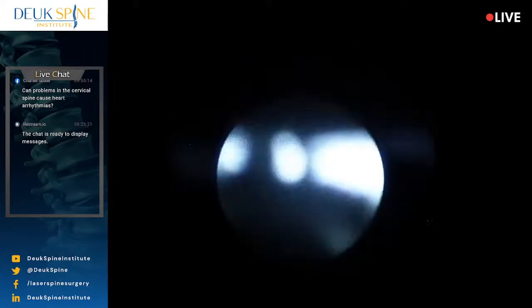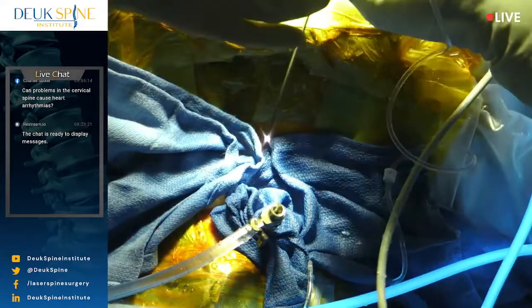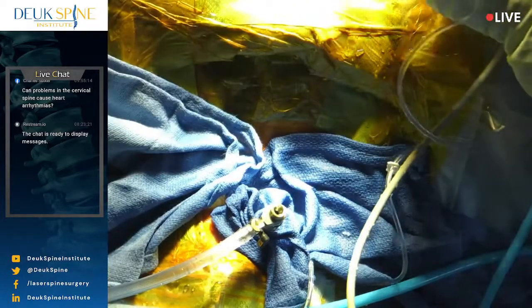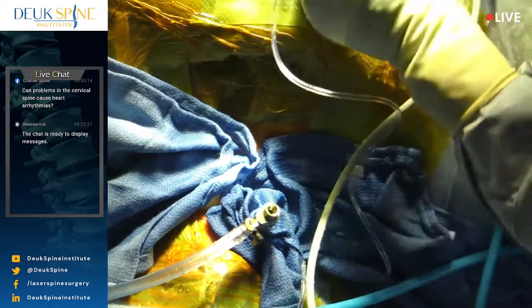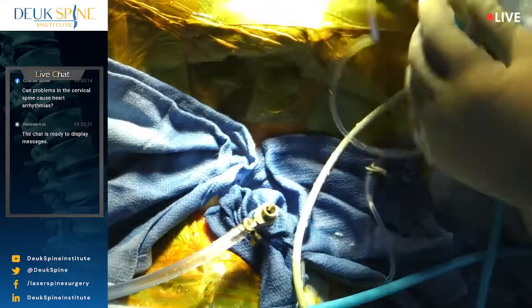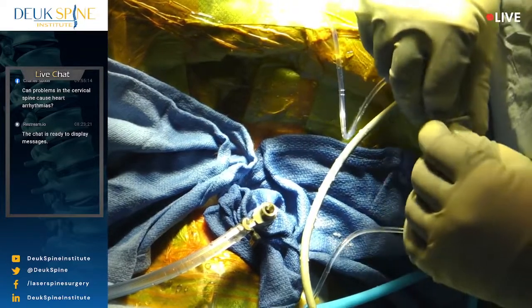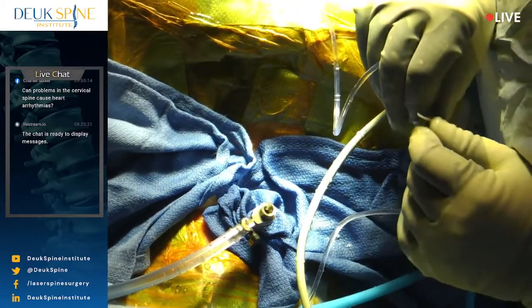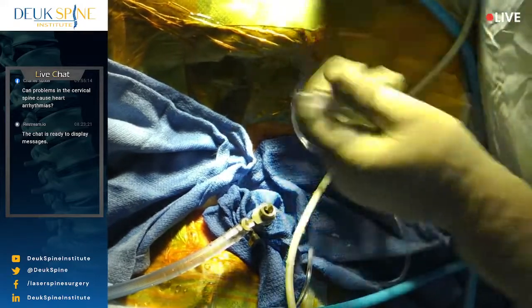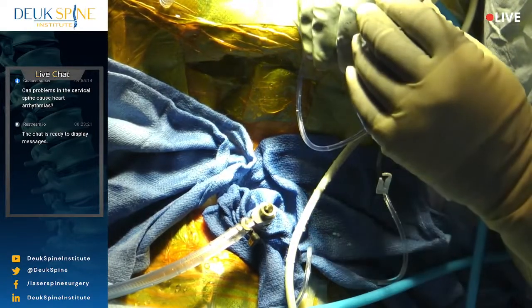So one of the reasons we broadcast is so you guys can see what really happens in the operating room and how we troubleshoot things. Right now, we believe there's a problem with the scope. Do not take this off the field. Leave it on the field, just in case it's not the scope. So we're gonna change scopes. These scopes run around $13,000, $14,000, close to $15,000 per scope. Looks like it should be a lot less than that, but that's the going rate.